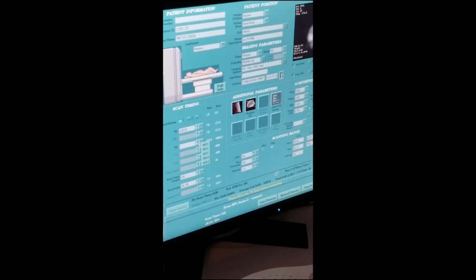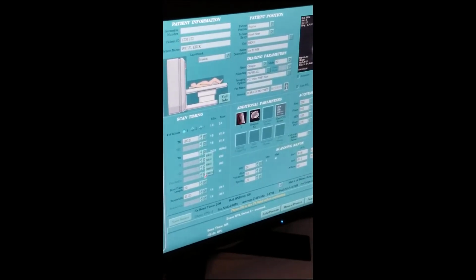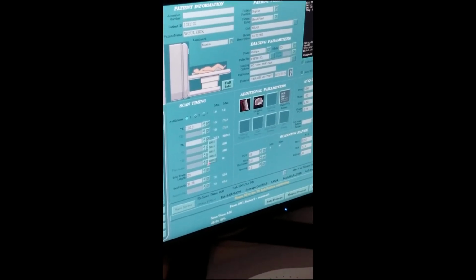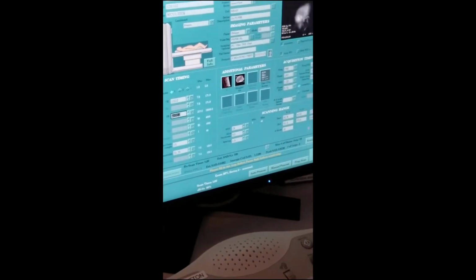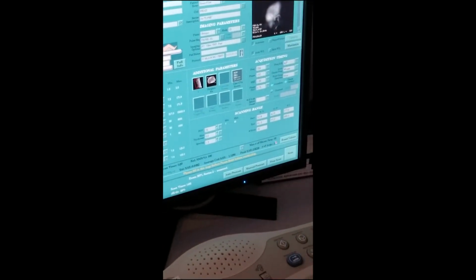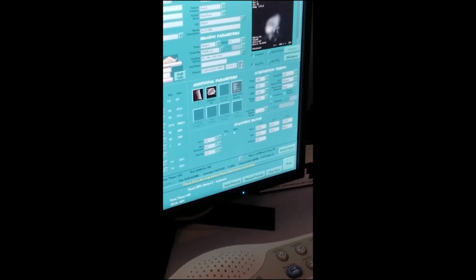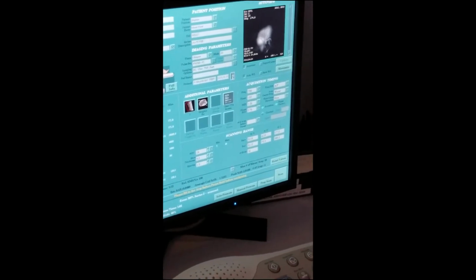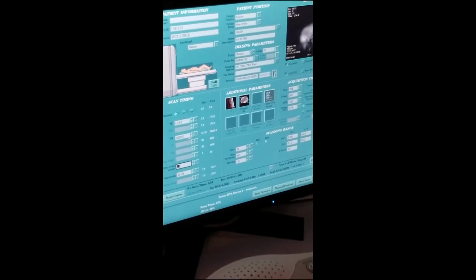So TR is anything over 2,000. How much do you need? I don't know. How many slices do I have? 26. Let's try a number. Try 4,000. What is it? 19. So higher is better. Okay, so let's put 6,000. Just type in 6.